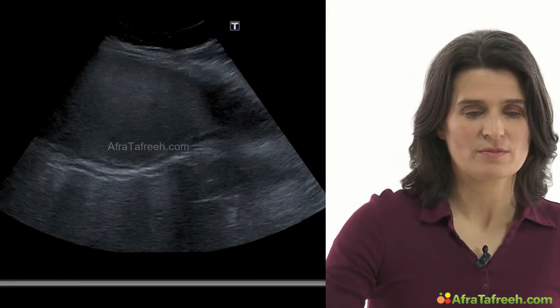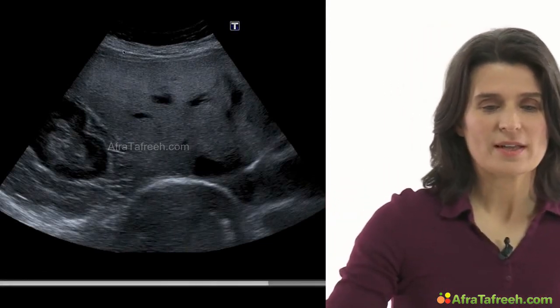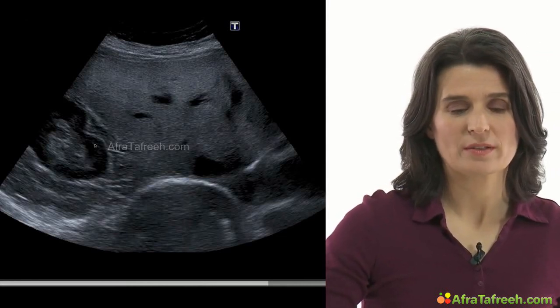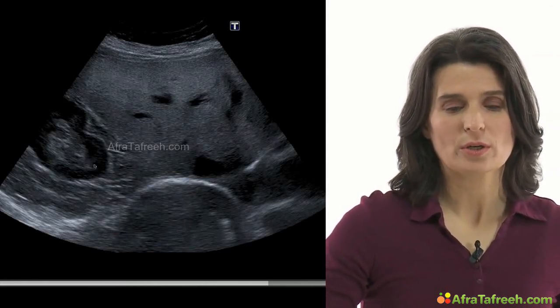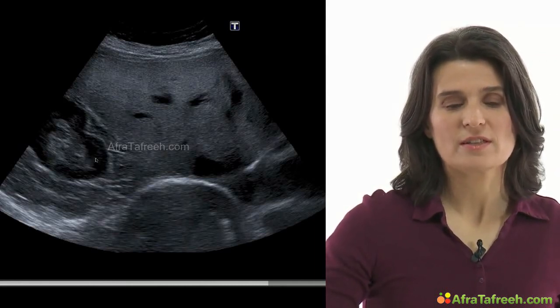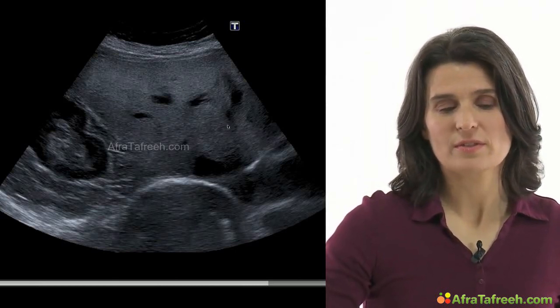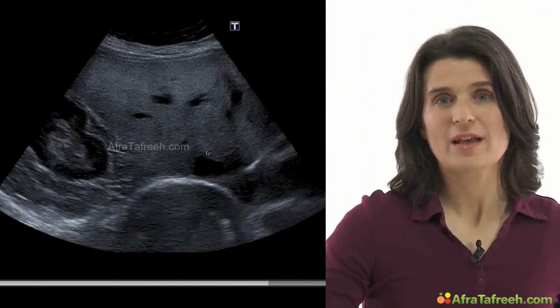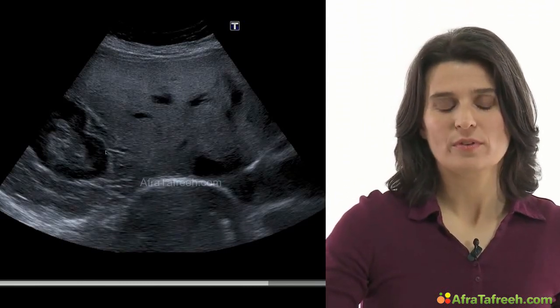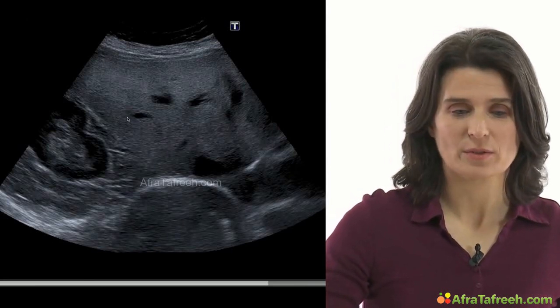Okay, I try to stop this video at the right place, over here. Now let's take a look at the liver. It's the right liver lobe over here, and in the neighborhood we got the kidney. So when we look at the kidney over here, at the renal parenchyma, it's a lot darker than the liver over here. You see the liver is quite bright, is hyperechoic, there's more reflexibility, a lot more than the renal cortex. This is the first and a very important sign for hepatic steatosis.